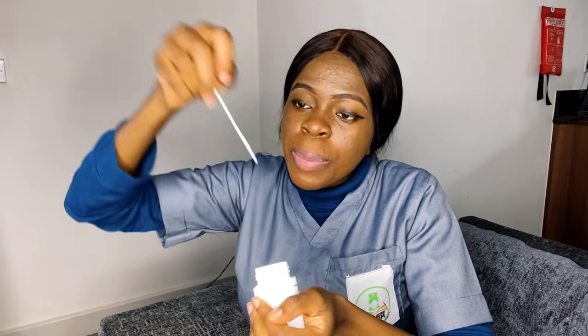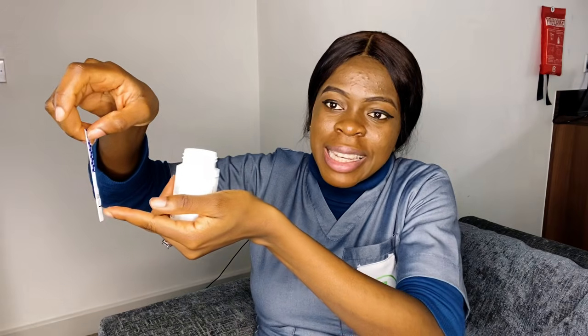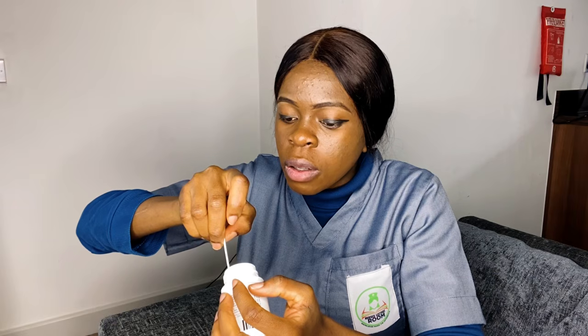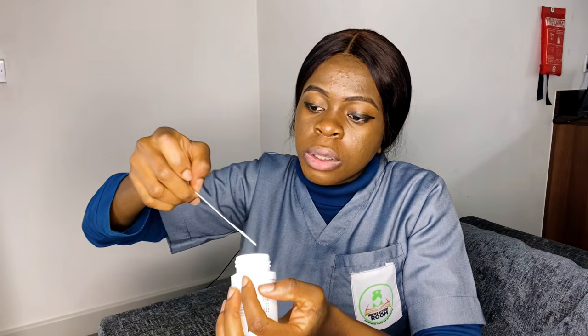So I'll dip it to the maximum level. Don't pass that. Most people just pass it. They feel if they pass it, they will get more accurate results. Sometimes they do get their own results, but generally, just obey the simple instruction. This is the max, the line that they say you should get it to. So I'll just do that now. For this other sample, I'll take it out and drop. The two samples are here.